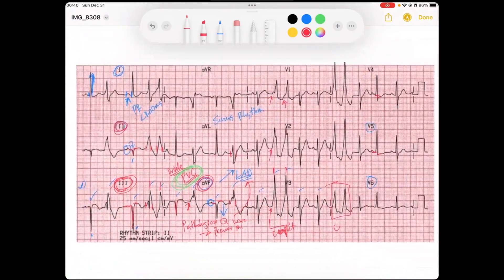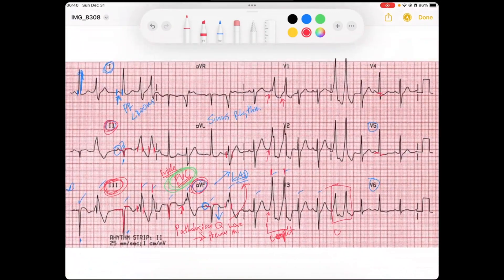So what's the diagnosis on this EKG? We've got sinus rhythm with left axis deviation, ST elevation in the inferior leads with reciprocal changes, premature ventricular contractions, and inferior pathological Q waves.